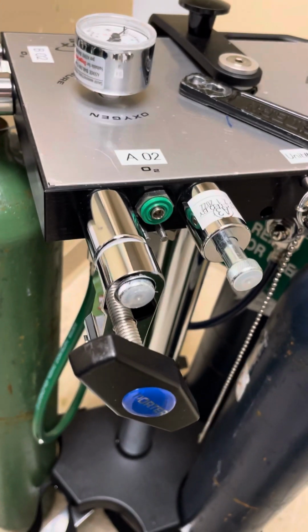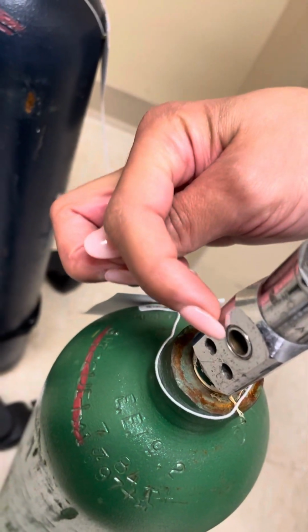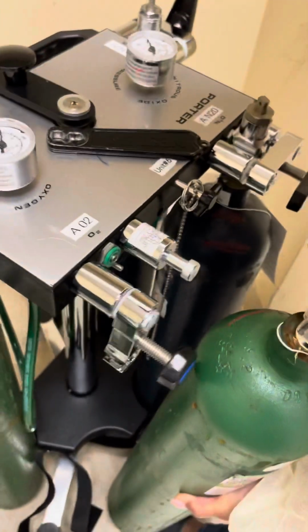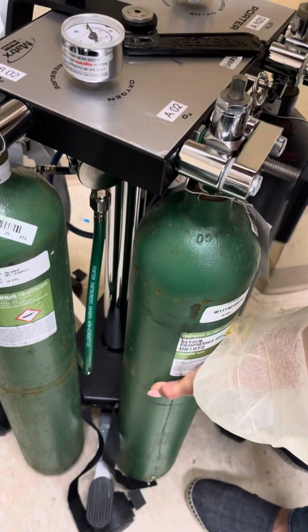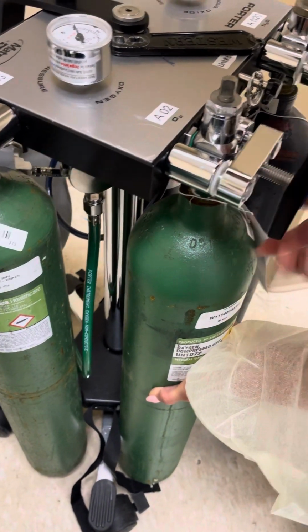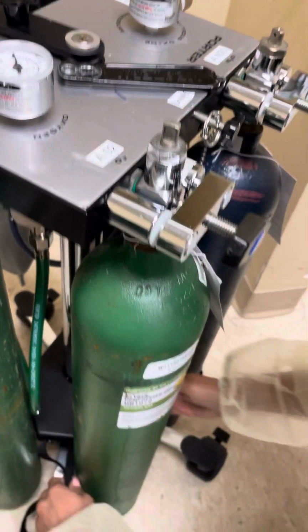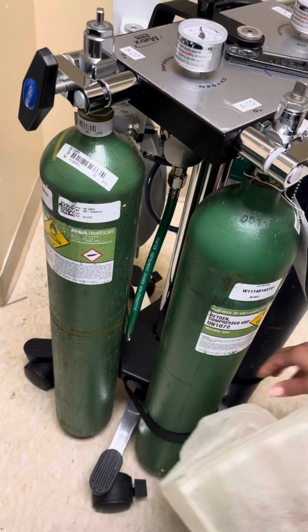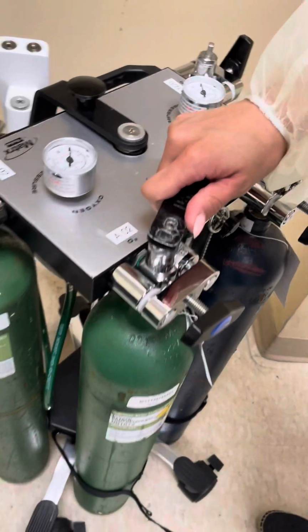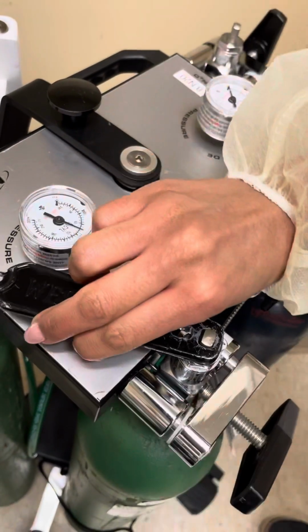So when you look at the tank, you're going to make sure that you find the little holes where the pins are at, the ones with the bigger holes, that's the side you put on. So you then take the tank, line it up, then you close the latch, spin it closed, make sure it's really, really tight, and then you strap it back in.